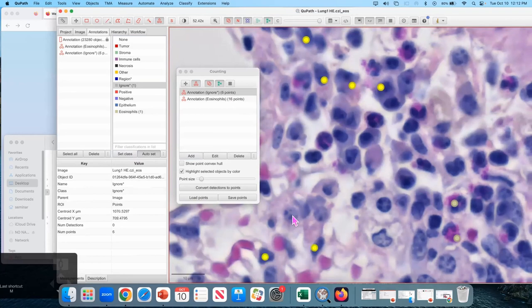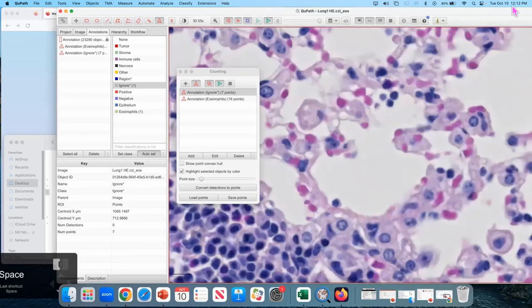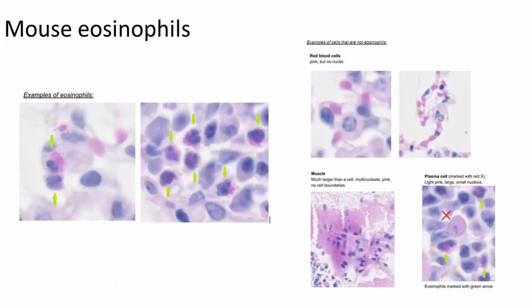Click on anything. You can merge the annotation types you do for this, right? So you can click on eosinophils, but then if the majority aren't, you can absolutely click a giant area. Yes. Whatever works for you. Okay.